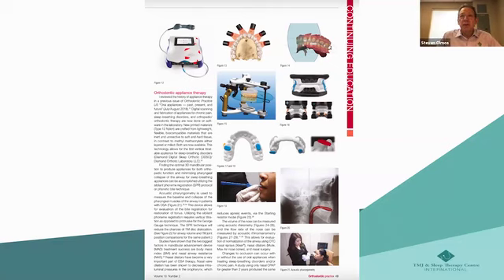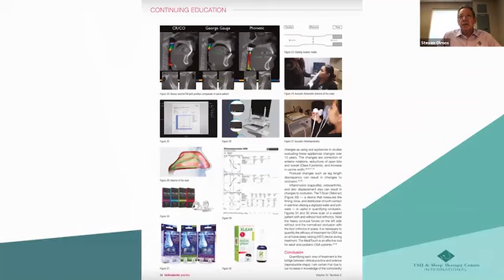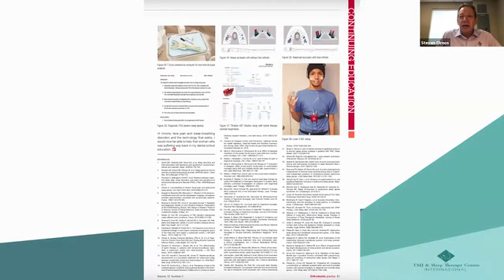Printed appliances: this is something new where we are able to use biocompatible materials of various designs for both pain and breathing, and evaluation of the airway. It's basically sonography-type imaging where we're bouncing sound waves through the pharyngeal areas, and also the nasal areas. In the pharyngeal area, it's called pharyngometry. In the nasal area, it's called rhinometry. Those are measuring volume. And then we measure flow rates, because you're going to see the correlation between nasal obstructions and chronic pain issues. So we'll show how to manage that. Digital evaluations of bite, T-scan, timing and frequency are necessary instead of just colored paper.